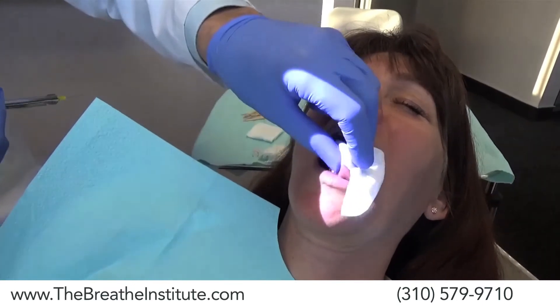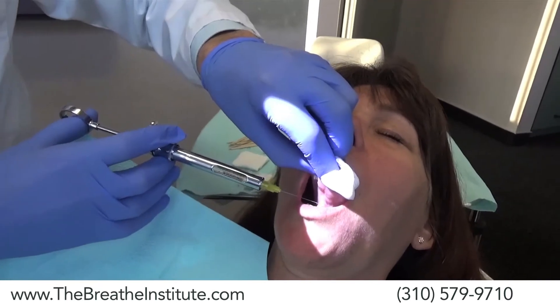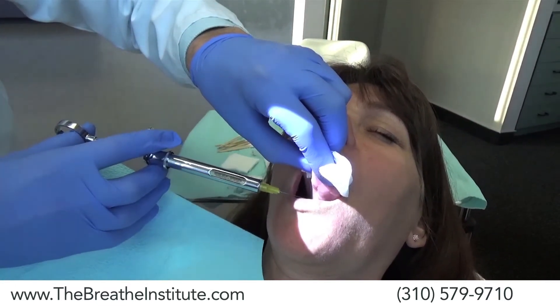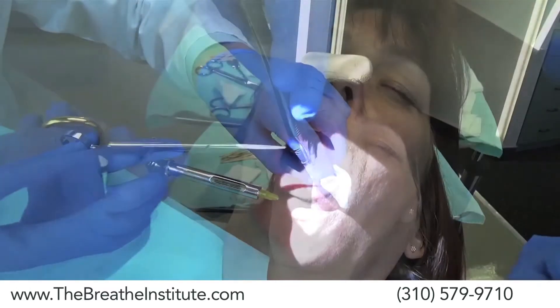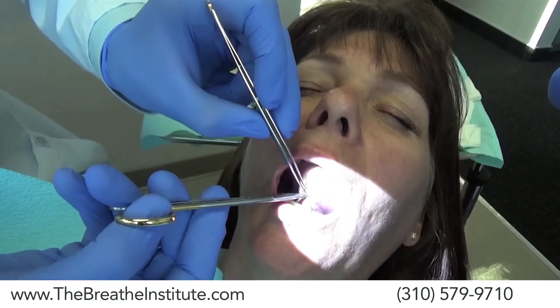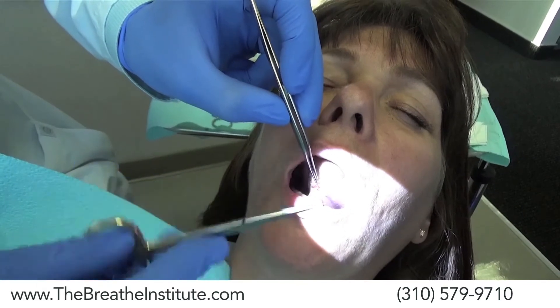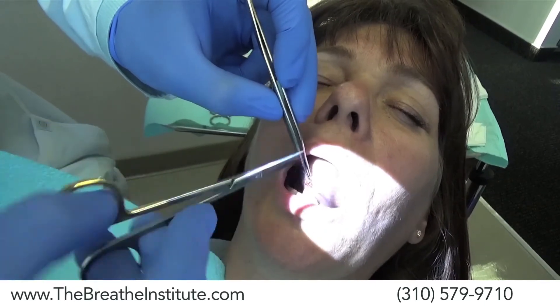Dr. Zaghi is now going to start the lingual frenectomy. He's developed techniques to try to make the experience as pain-free as possible for the patient. Deep breath in... slowly, slowly let it out. Dr. Zaghi is starting to very carefully and precisely cut for the lingual frenectomy, making sure he cuts as little as possible so there will be as little scar tissue as possible while getting the maximum release of tie-down material.